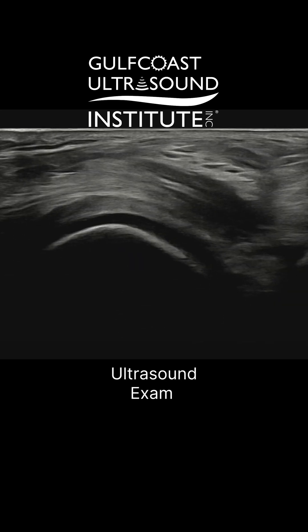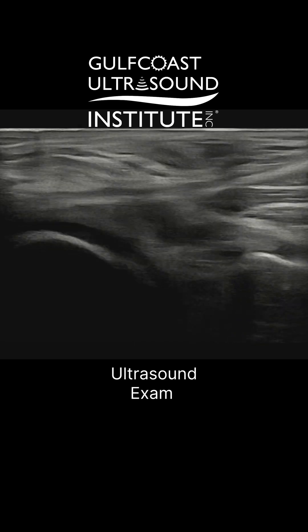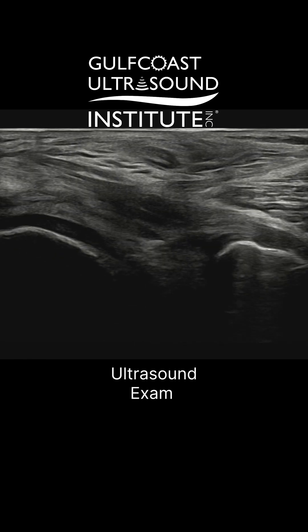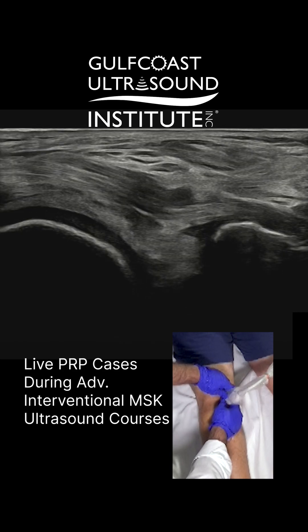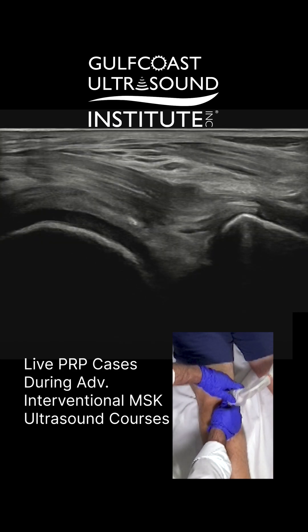So there's this femoral condyle that we can see. The left of the screen is proximal, the right is distal. We have our femoral condyle and we have the tibia, and then in between them is the posterior horn and the medial meniscus.